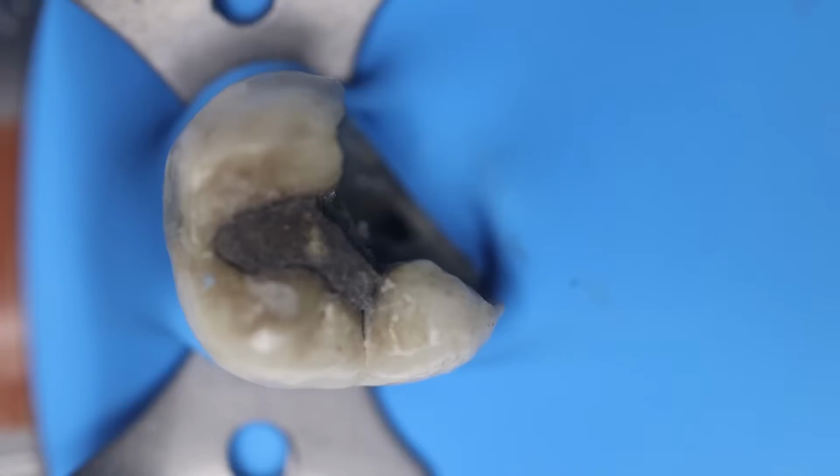Okay, good afternoon, doctor. So, we are just beginning with the demonstration of access opening that we learned in the last session. This is a mandibular molar and that is grossly carious. I selected this tooth because we don't get an ideal, just a sound tooth to do an access opening. We will definitely do that, but let us start with the carious molar that is grossly decayed. We don't know how to approach such teeth, and we want to save such teeth. And in that saving process, the first thing that we can do is to begin with the access opening.